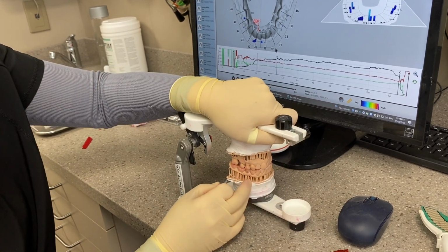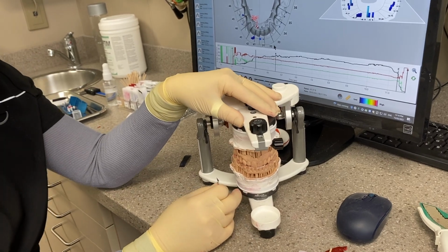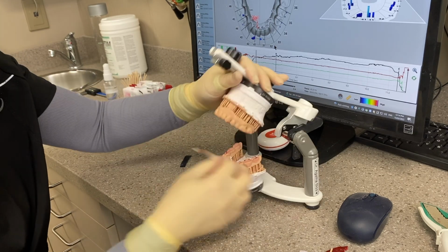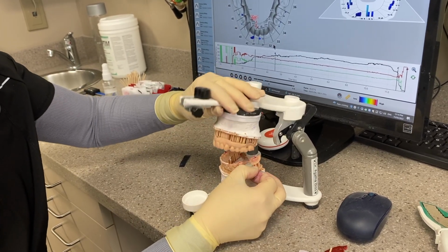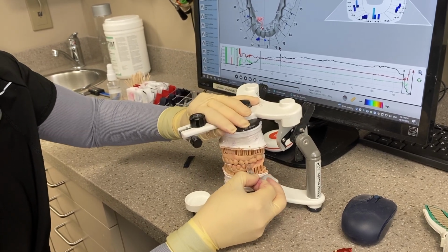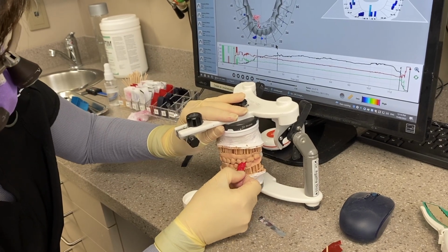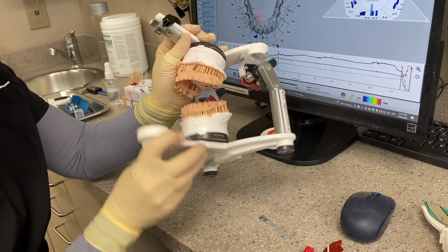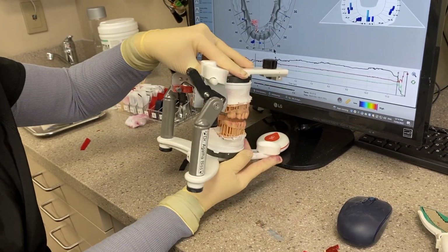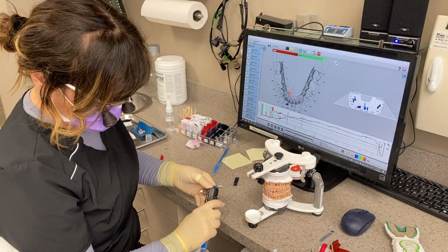And she's got a class 3 tendency anyways, right? So no wonder she's here, and I have a feeling she'll actually even come forward a little bit more, which is kind of a concern. But okay, so I've got no contact on the right side. So then the question is, and she's got solid something there. So the question now becomes, as you do this, what's her vertical? So let's see where she's hitting first, because if I've overclosed her, then I'll need to open her up. Where's that contact? I'm just gonna measure real quick.